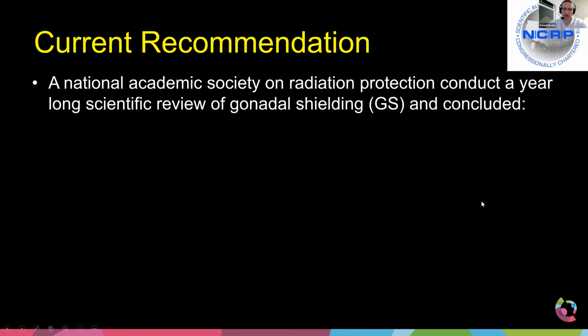And in the US, typically, you can write a position statement, you can write a paper, an editorial statement, you can do all that. But a lot of things don't change. The educational models, the rules, the laws in each of the states, those things don't actually change until, as an example, our NCRP society comes out and scientifically says, yes, it's a good thing to change. So this position statement of don't use gonadal shielding came out several years ago, but the NCRP statement just came out at the end of last year. And so for the most part, we're starting to see a more rapid shift here in the US of moving away from gonadal shielding.